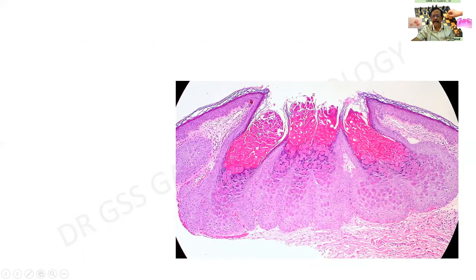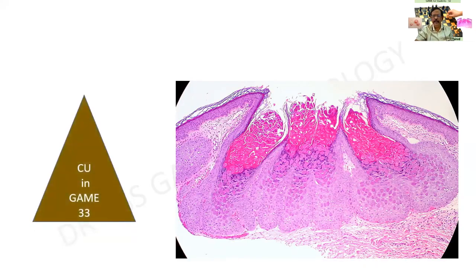And this is it. Once again, I repeat, the epidermis thrown into folds is called acanthosis. There is hyperplasia, and the layers are showing multiple inclusions in each cell. They are all eosinophilic, and the topmost layers are getting denuded, facilitating the spread of the disease.